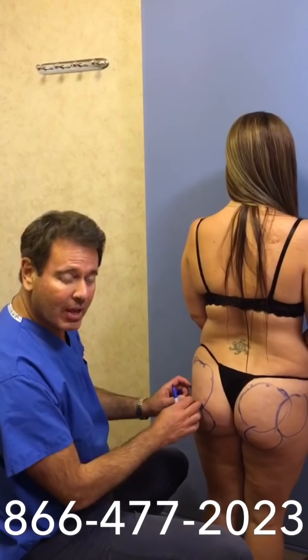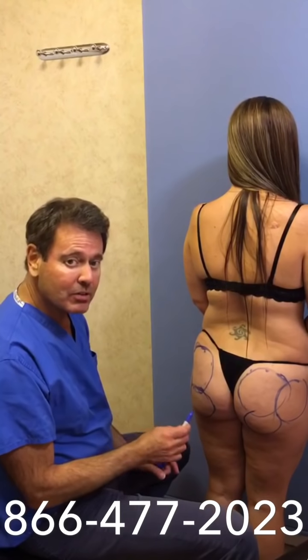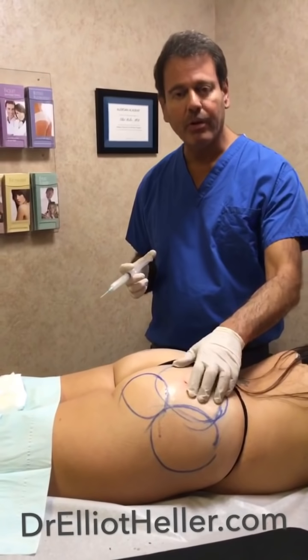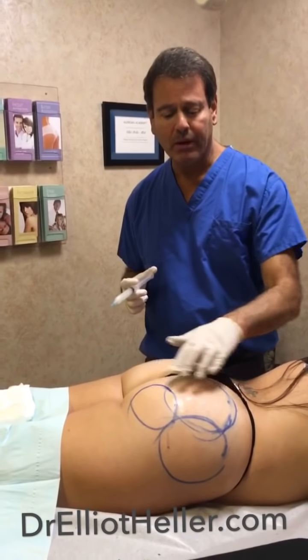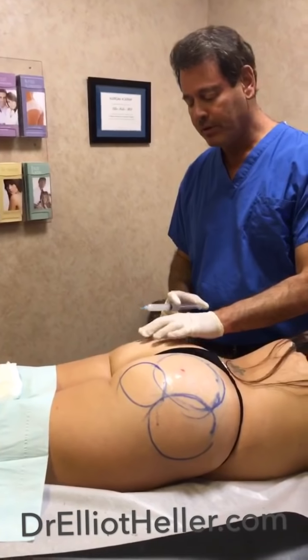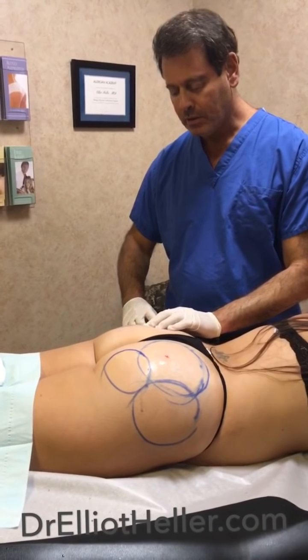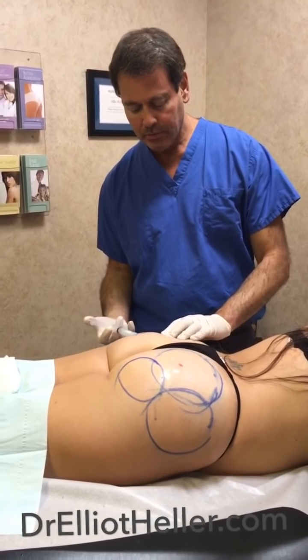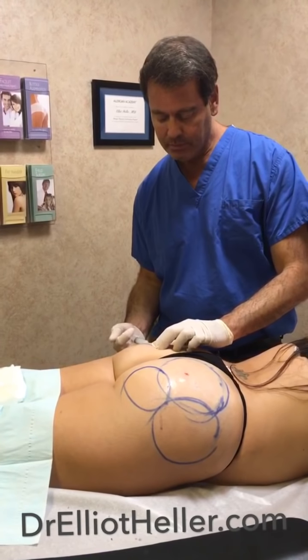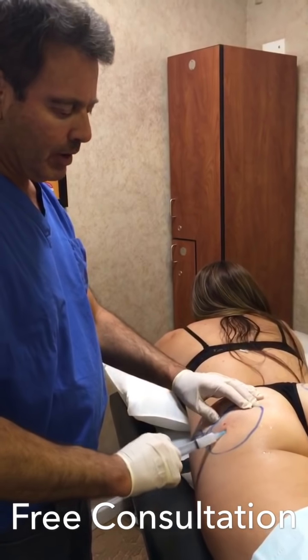We're going to put four vials of Sculptra on each side today to make it rounder and fuller. The patient may require a second session, but we're going to see what we accomplish with the eight vials today. We have the area prepped with antiseptic and we outline our zones that need fullness. We take our Sculptra, which has been diluted, and do a small incision with a needle only — there's no cutting. We slowly fill in a circular manner to get the biggest bulk we need. There is novocaine mixed in, so it makes it very pleasant.